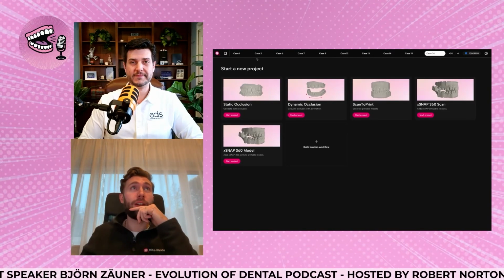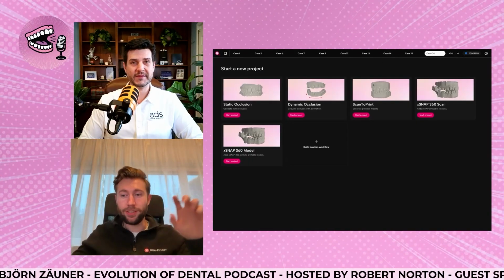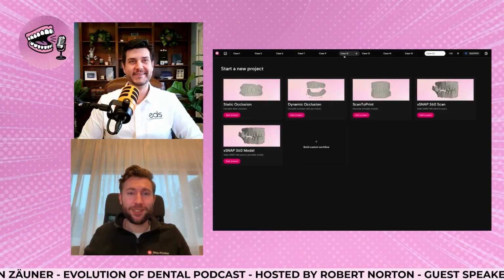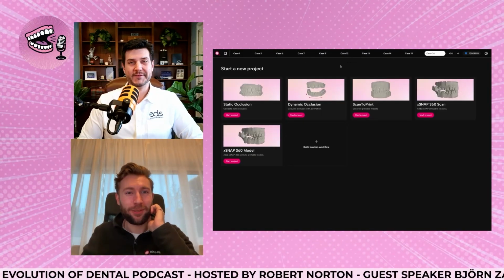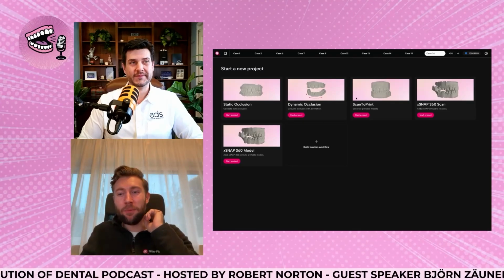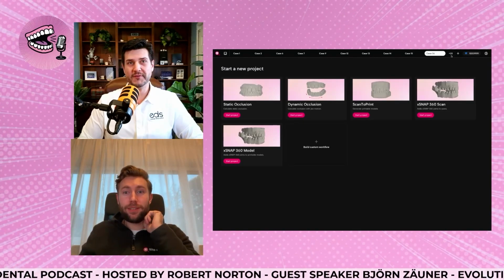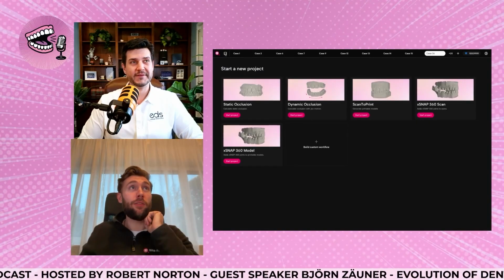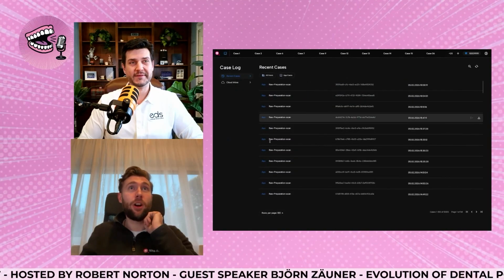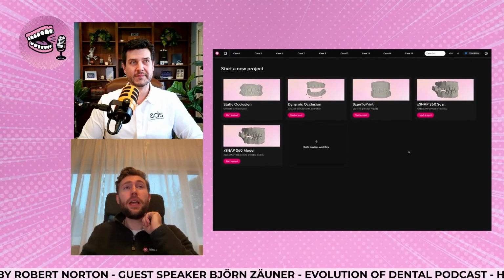I'm a bit of a tab-messy person, so in the browser I always have a gazillion tabs open. Now I also have a gazillion tabs open in BiteFinder, which is nice because I work on a lot of cases in parallel. You can open a bunch of them in parallel, which is really cool in and of itself. We also had big requests for a case log where you see previous cases and reload them. That was cool.